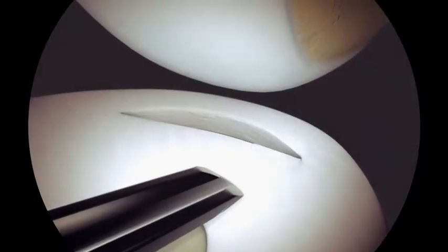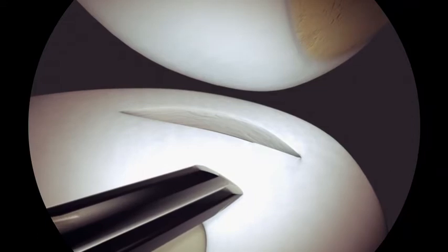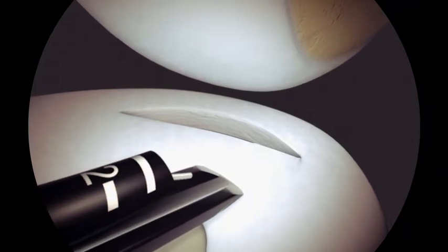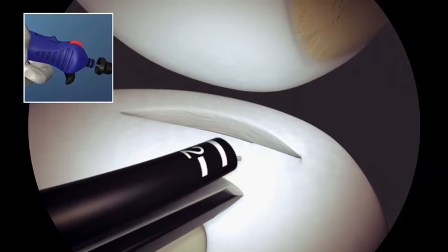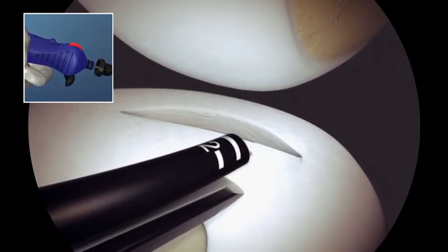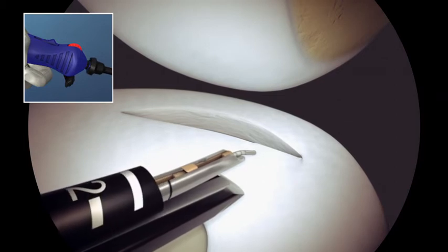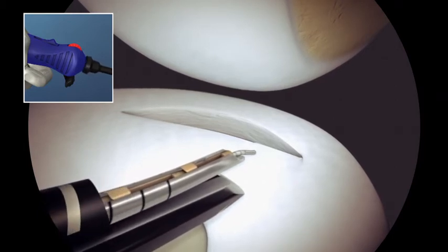Insert the sequent entry cannula into the portal. Introduce the sequent device along the concave surface of the entry cannula with the depth stop sheath covering the tip of the needle. Pull back on the depth stop sheath until it engages fully onto the handle.